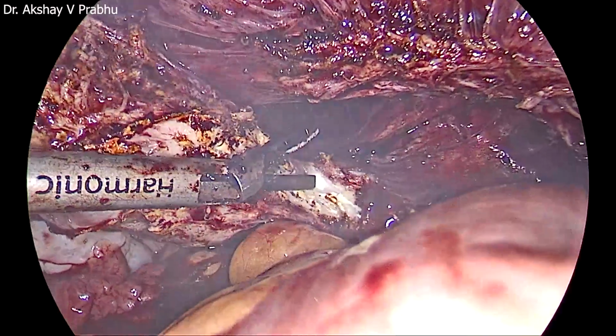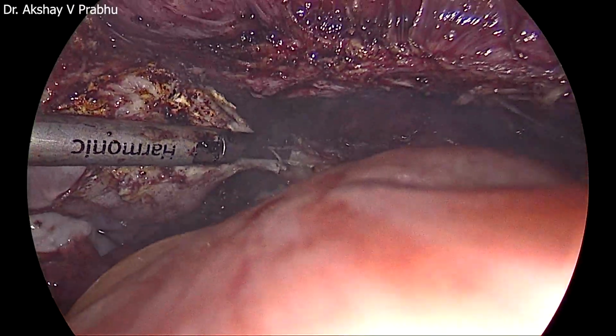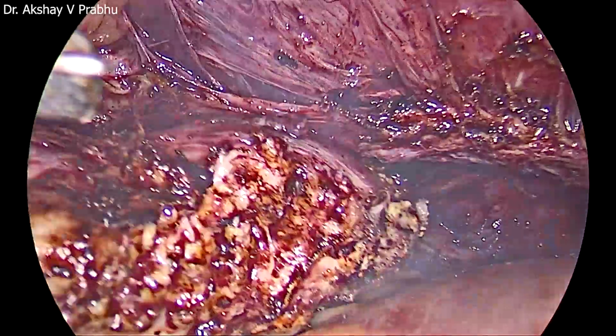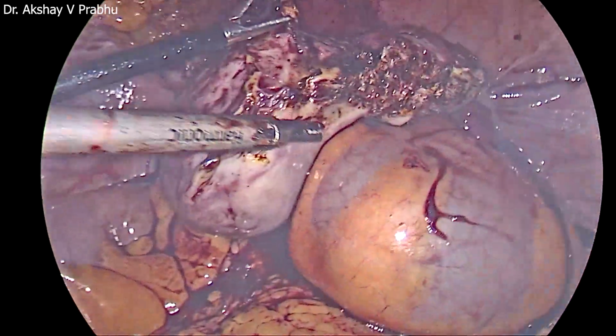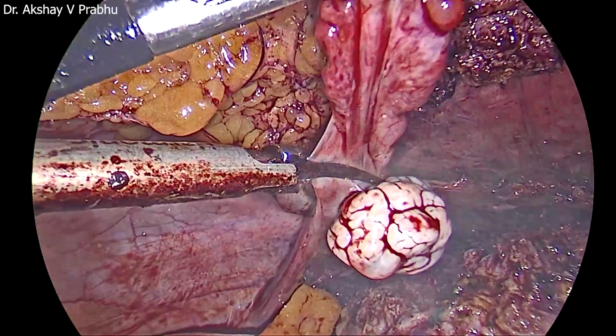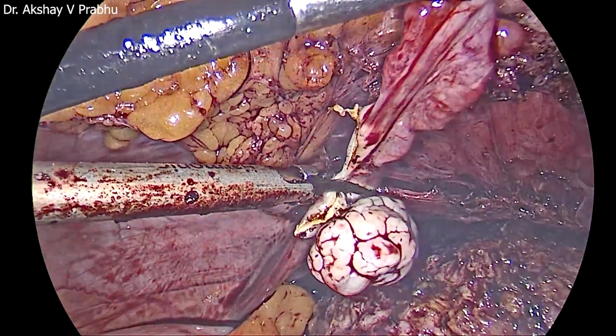We're almost nearing the end of the steps. The specimen will be out soon. Yes. So the hysterectomy is complete. Now you can see the adhesions persisting on the anterior wall, where they have been, how they have been retracted, how the bladder has been tackled. The fallopian tubes are being removed in this case.